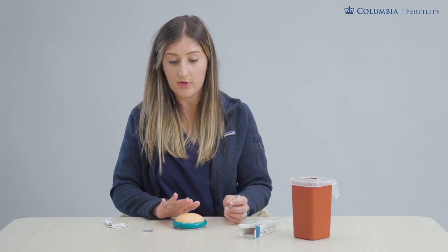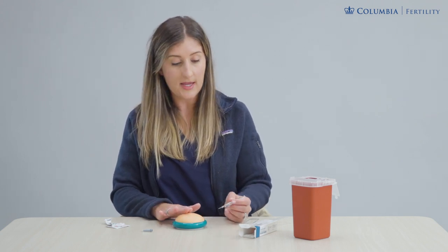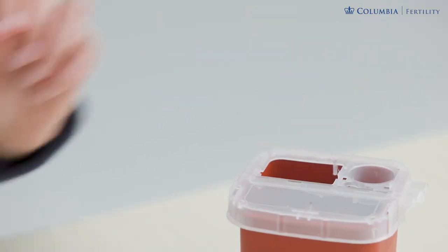Once it's done we remove the needle. You can hold gauze over top if you'd like. This is now empty and we're going to throw it in our red sharps container.